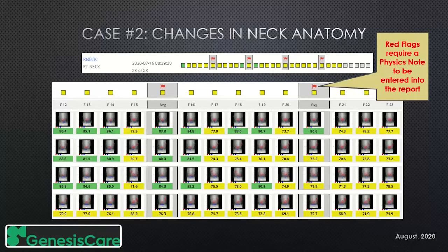This is similar to what you've seen before, except you do not see any red chiclets or any red boxes. There were no gamma failures here. These are all borderline tolerance results. Now, the reason I did this screen is because this particular patient had been archived out of the Adaptivo server. So we had to restore the patient.